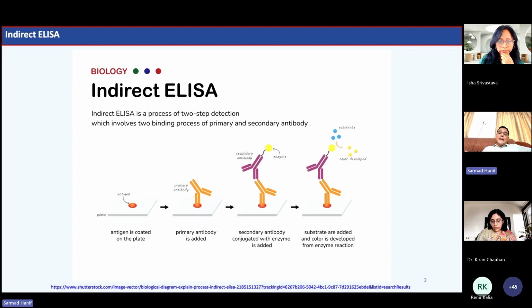On the other hand, the secondary antibody is bound to an enzyme, which in this ELISA technique is the peroxidase enzyme. So now we have a complex. In the third part, if you see, we have a complex wherein we have the antigen, then the sera from the mice or the humans, animals or humans, whatever sample we are taking.